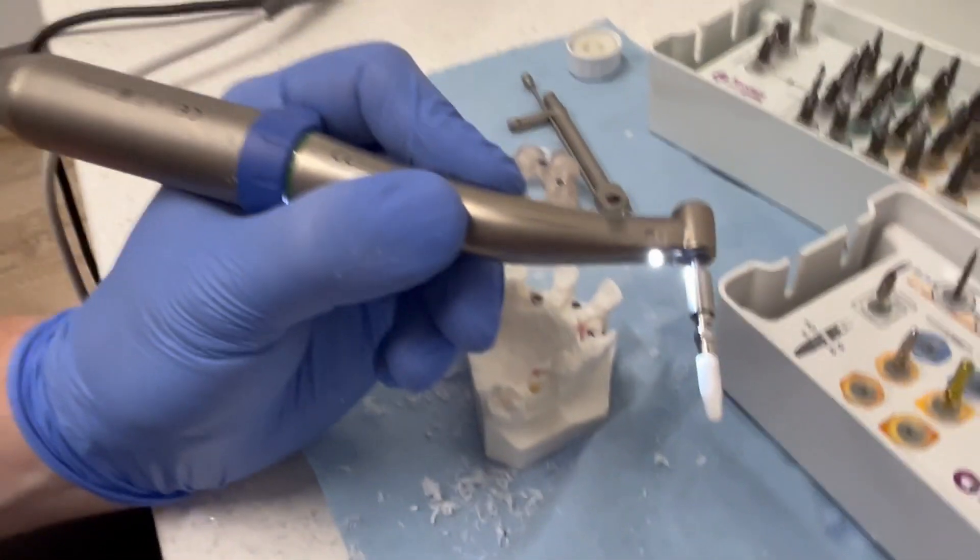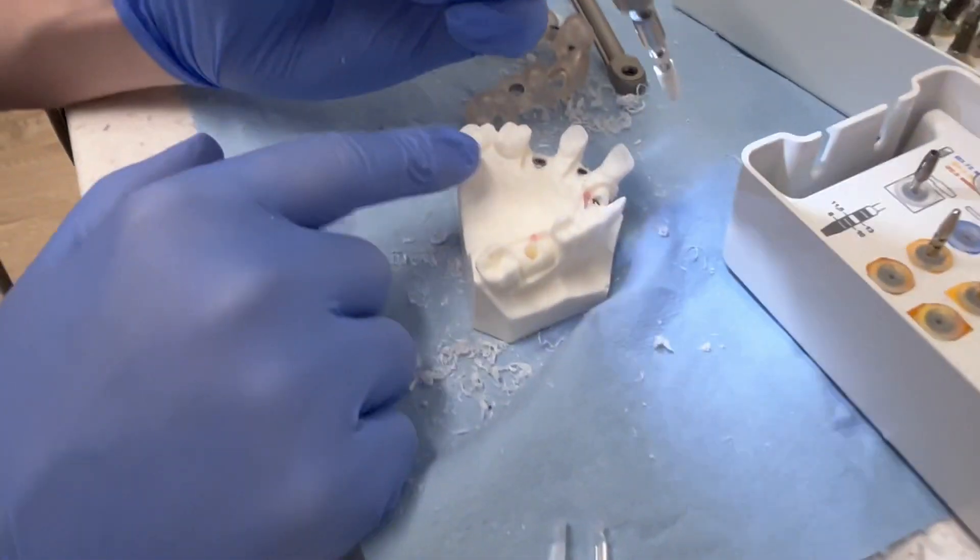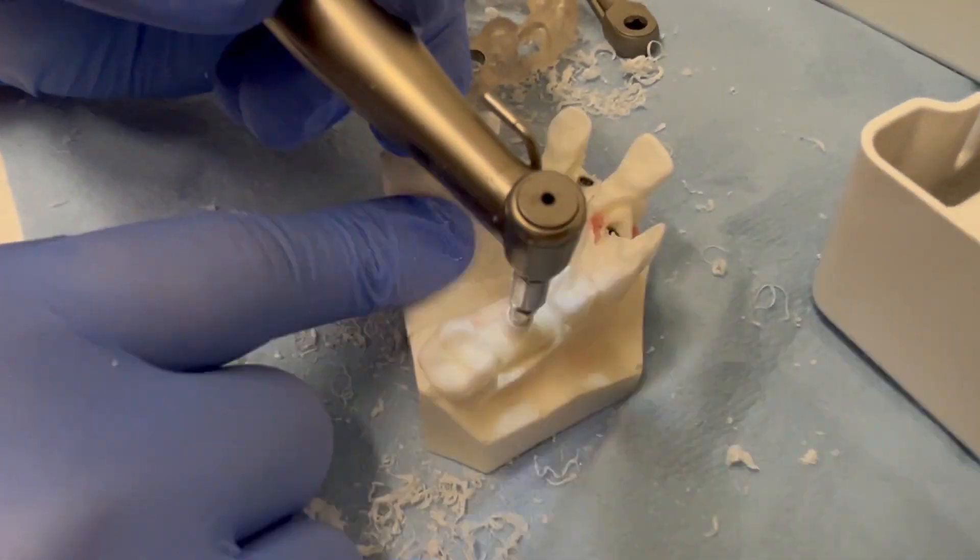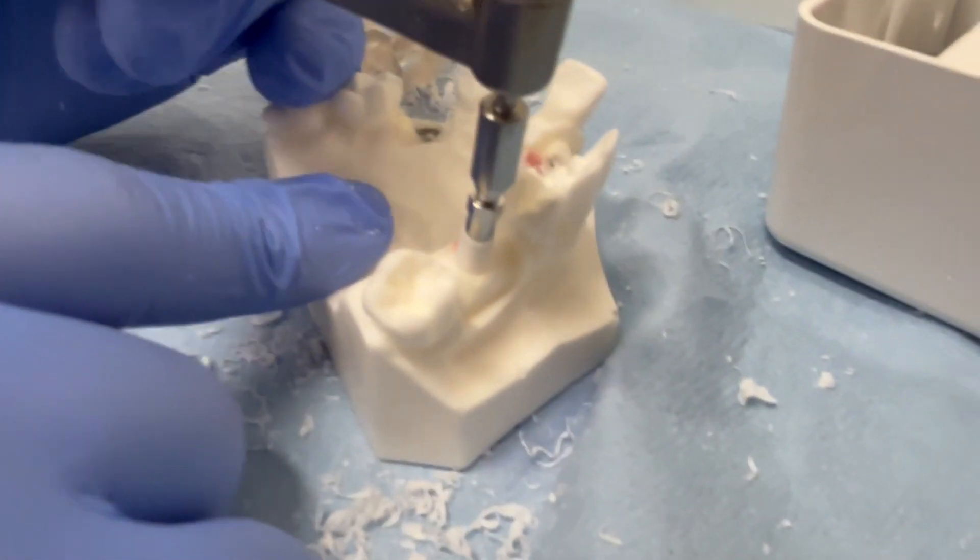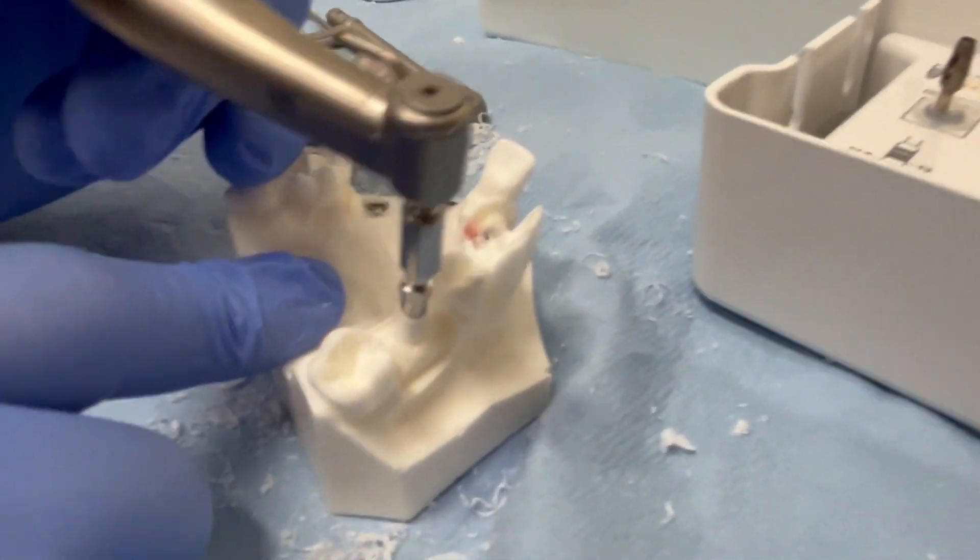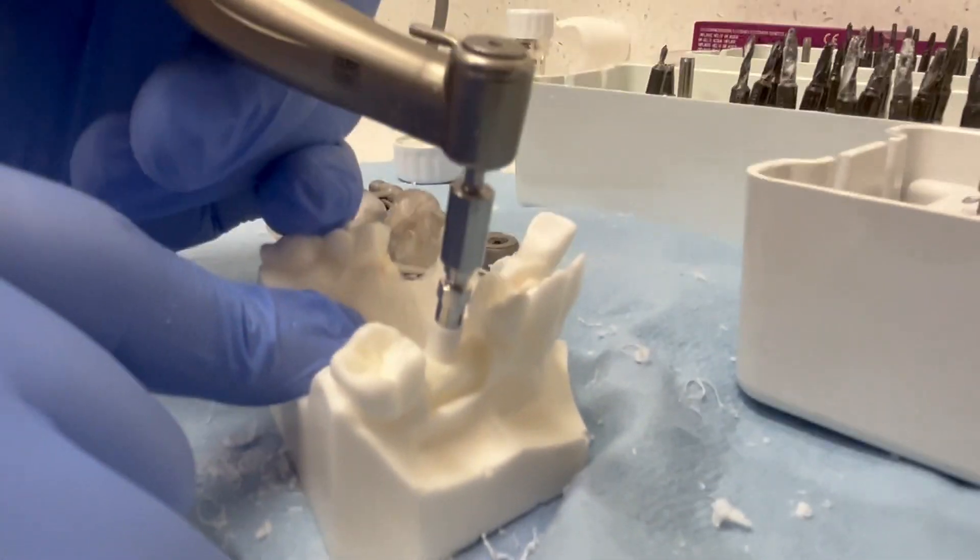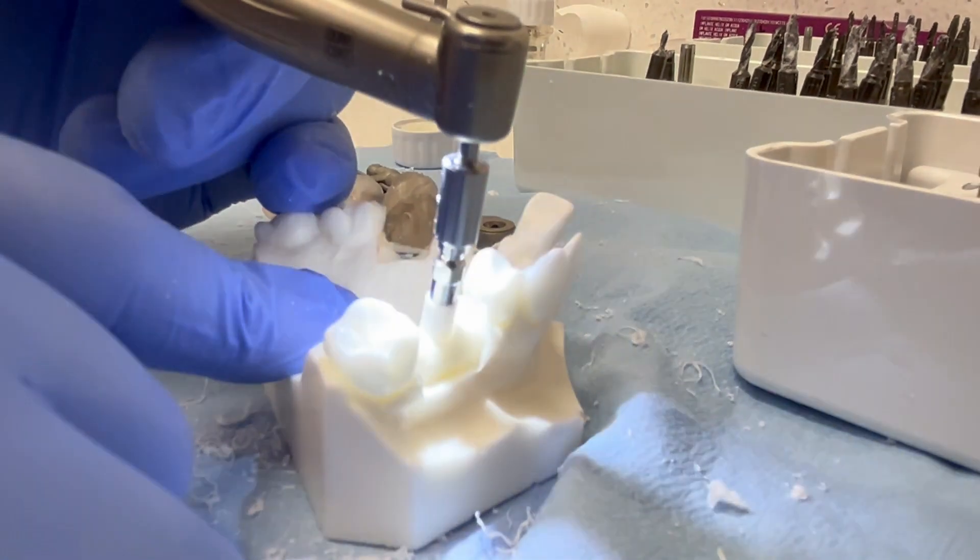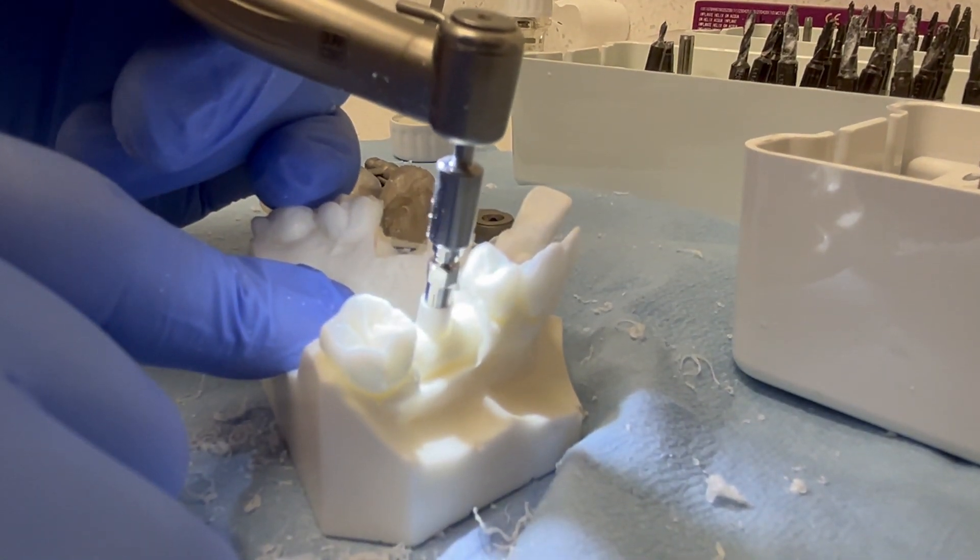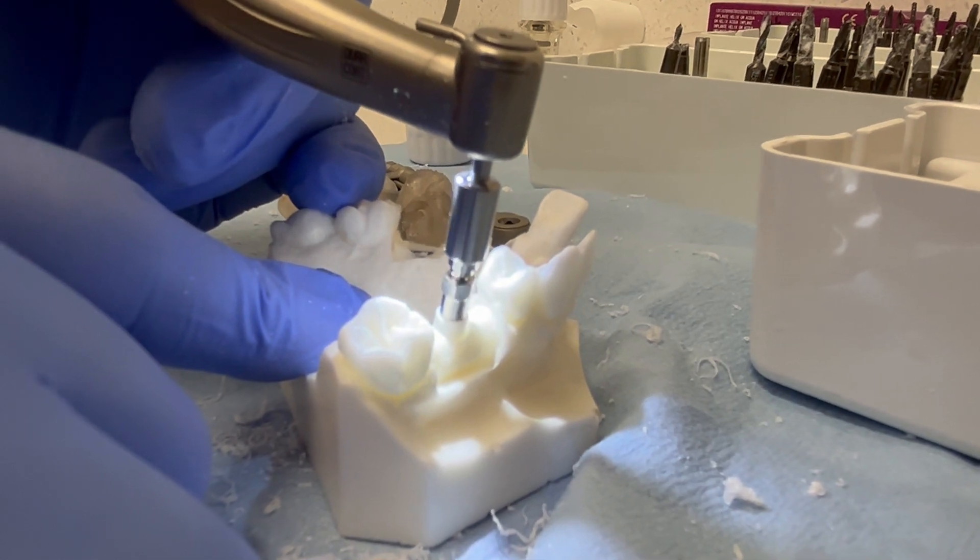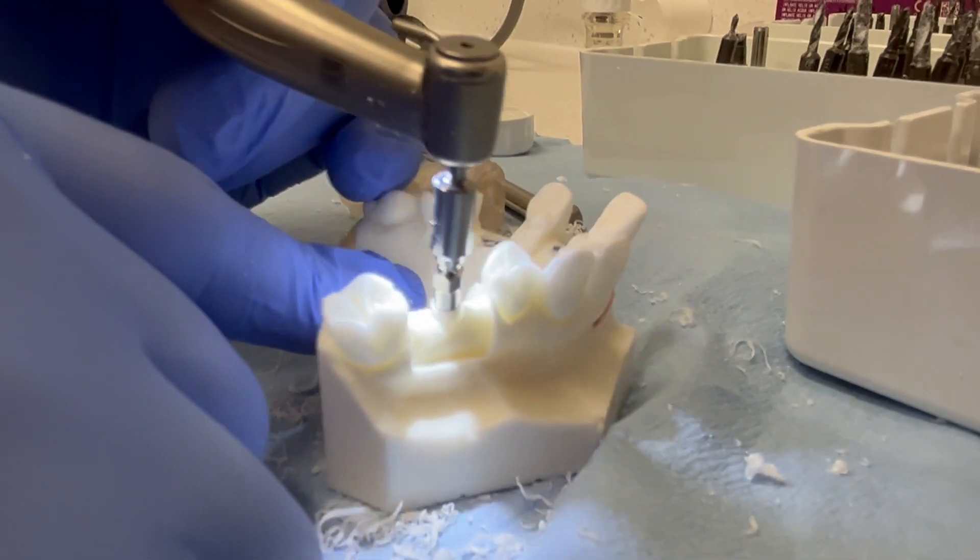We'll check our speed and torque, make sure we like everything. And now we're just going to our osteotomy site. And now unlike a titanium, like a GM implant, we don't want to lean on this implant during placement to try to change the position. We have to make sure it follows our osteotomy. So I'm really letting this do the work of following our path that we created with our guide.